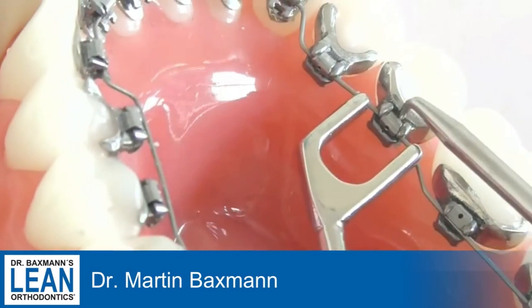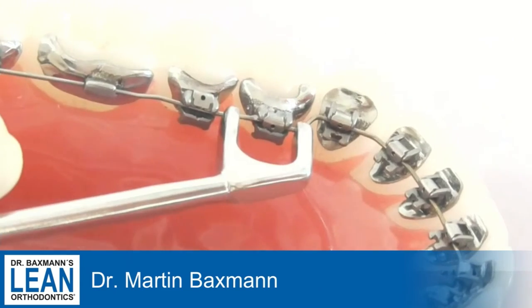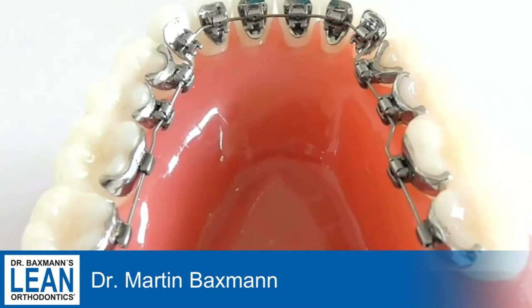So you can use it really easily for front teeth, for back teeth — all with the same mechanics. And it works for the right, the left, the upper and the lower arch. So you can use it everywhere. It's very simple and helpful.